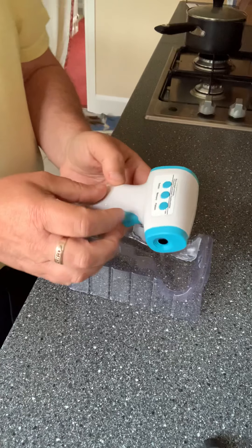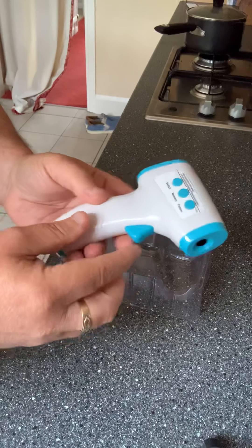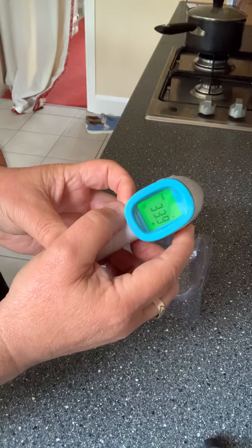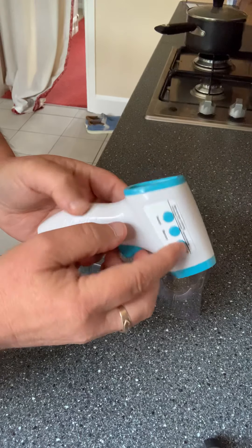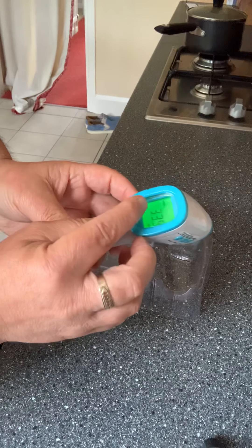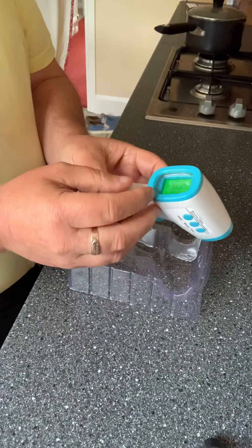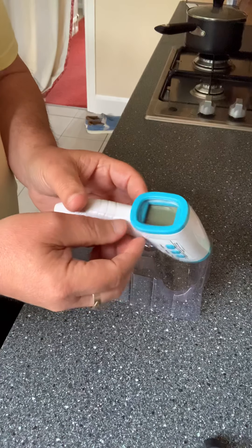There are three buttons. The main switch turns it on, and it allows you to toggle between Fahrenheit and centigrade. Then there's a setting for surface or body mode. The body mode has a coloured LED so that if the temperature goes too high — indicating a fever — it will turn red.